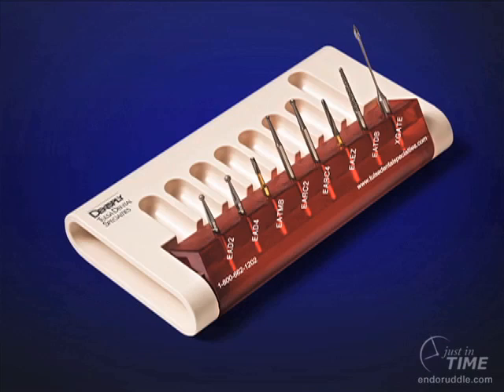There's not too many burrs that would be called upon to be utilized to prepare an access in any tooth. Typically, accesses can be cut and be completed in a very nice way with just 2 or maybe 3 instruments. So here you can see there's an access burr kit by Dentsply Tulsa Dental Specialties, and you can see there's a variety of burrs, but even though we have a variety of burrs, we're usually using just 2 or 3 burrs. Let's look at these burrs a little bit closer.